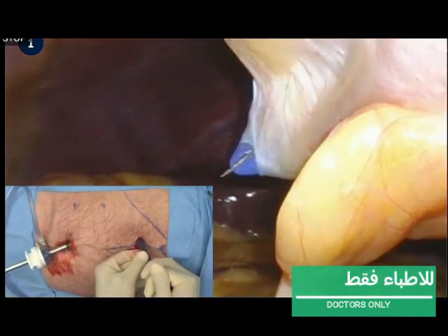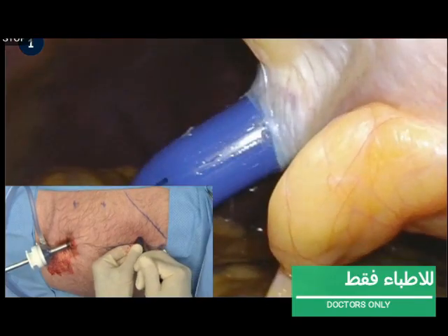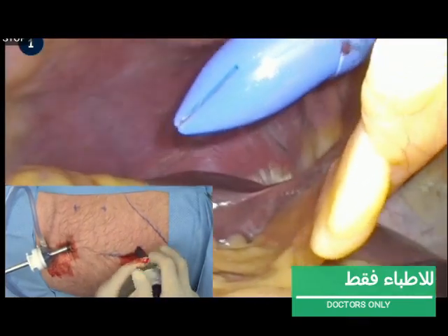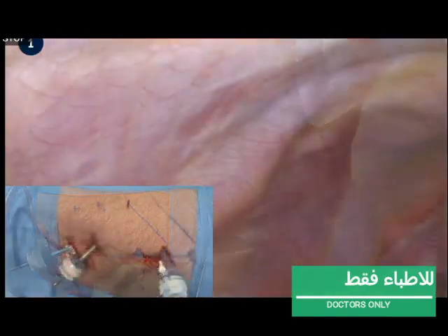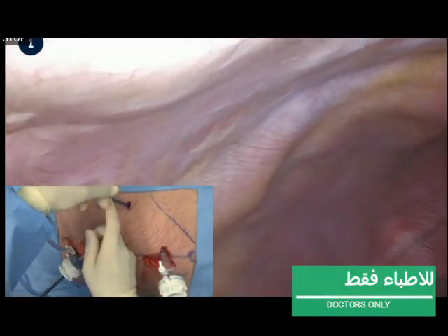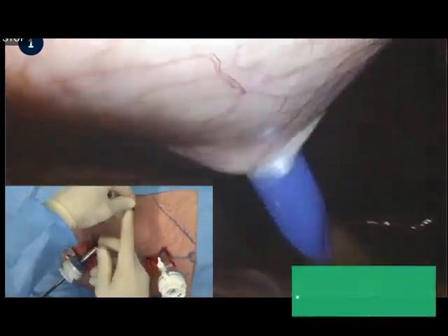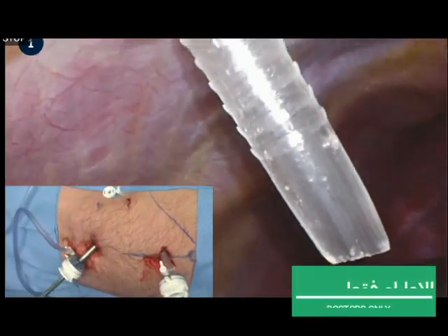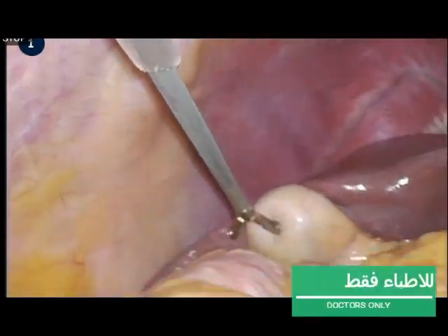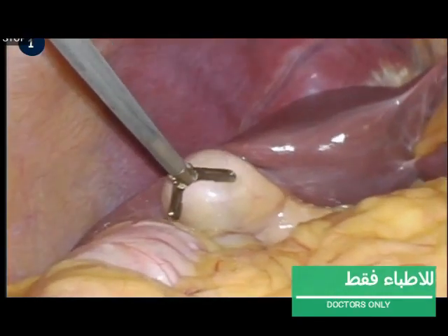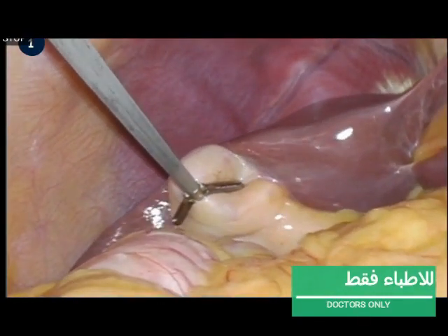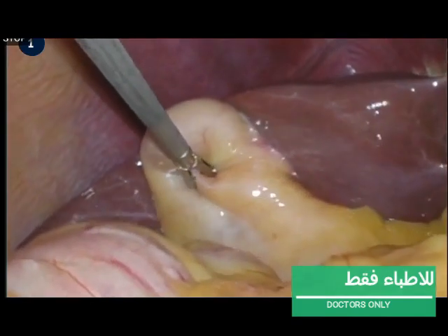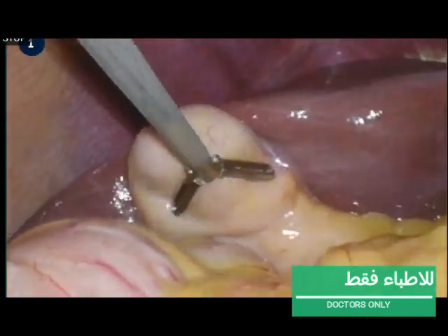You can clearly see the retraction of the sharp tip of the trocar. A third trocar is inserted in the right lower quadrant. A better view of the gallbladder can be achieved by tilting the table in reverse Trendelenburg and slightly to the left. The fundus of the gallbladder is grasped to retract the gallbladder superiorly.